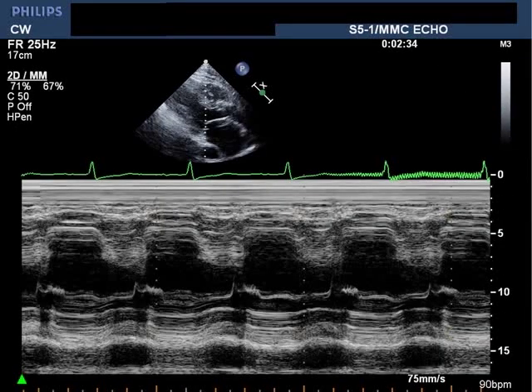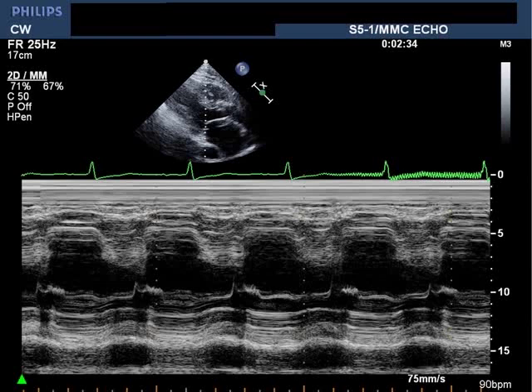This is an M-mode through the mitral valve in the parasternal long axis, and you can see two important findings. First, there is diastolic fluttering of the anterior mitral leaflet. Diastolic fluttering of the anterior mitral leaflet is commonly associated with aortic regurgitation — it is a marker of the presence of aortic insufficiency, but not a marker per se of how severe the aortic insufficiency is.